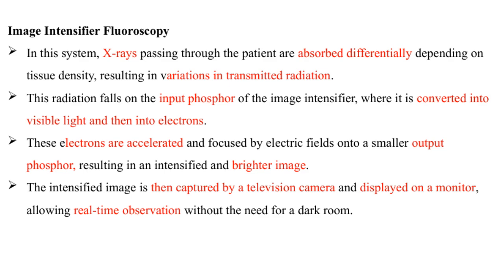It's essentially intensifying the image, which is crucial for better visualization during procedures. The intensified image is then captured by a television camera and displayed on a monitor. What's really advantageous about this system is that it allows for real-time observation. So, no dark room needed, and surgeons or clinicians can see the live movements and details as they happen. It's a powerful tool that enhances both safety and efficiency during imaging-guided procedures.